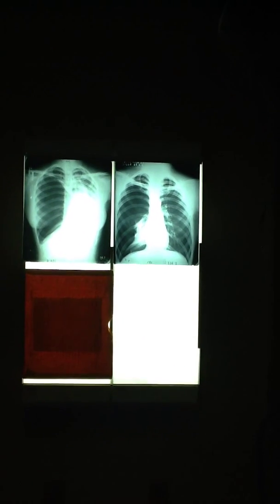These two are passive atelectasis examples. And passive happens either from pneumo, hydro, or fibro thorax. The term pneumo is air, hydro is liquid, fibro is scar, and the term thorax means it's in the pleural space. And those are the three that cause compressive or passive.